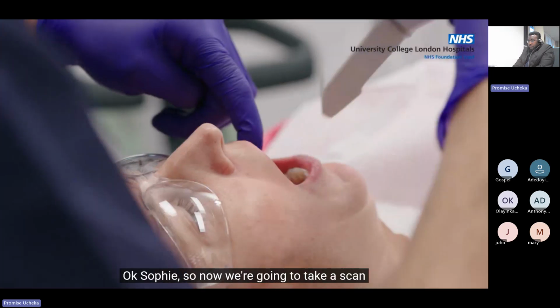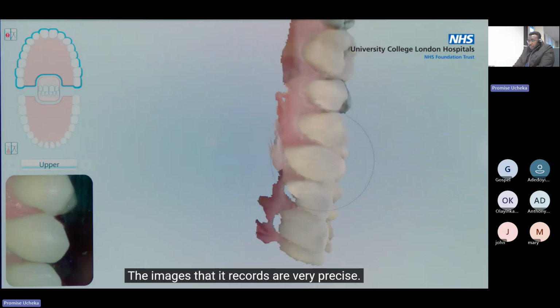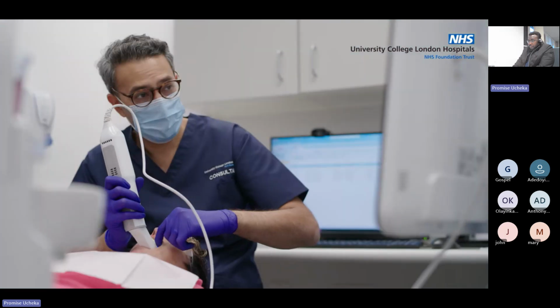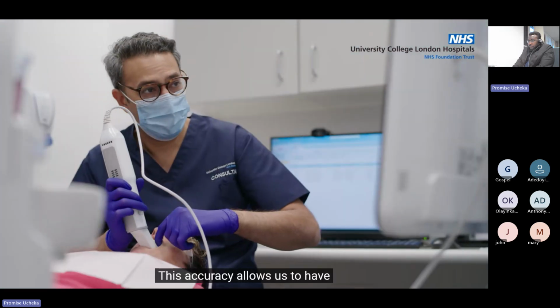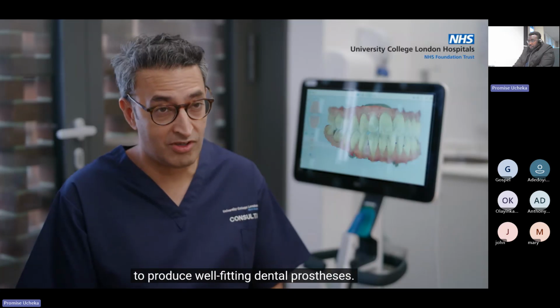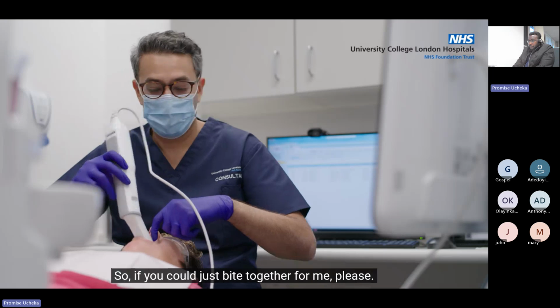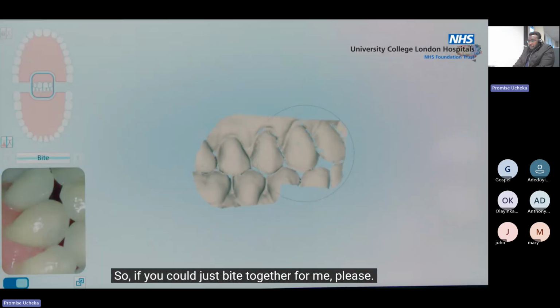You will feel the head of the scanner, which is recording the photographs, moving over the teeth, but it's entirely pain-free. Okay, Sophie, so now we're going to take a scan of the upper jaw. The images that it records are very precise. This accuracy allows us to have the precision that's required to produce well-fitting dental prostheses. Now we just want to record how your teeth bite together. So if you could just bite together for me, please.